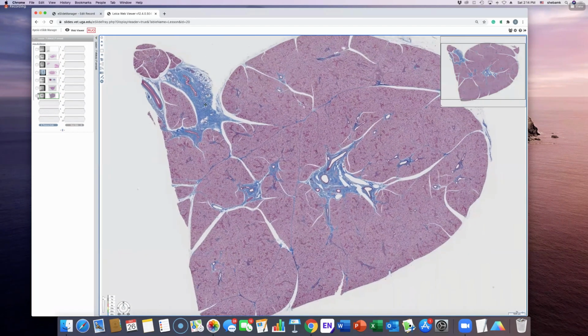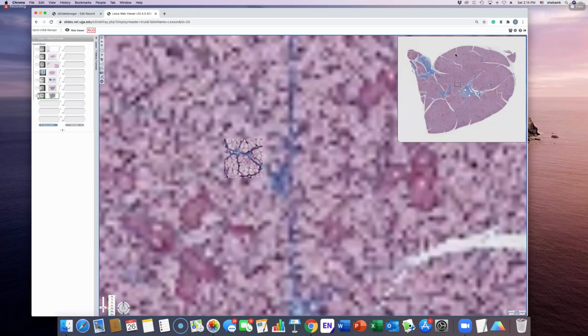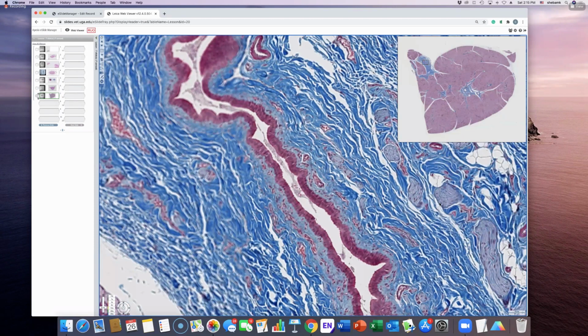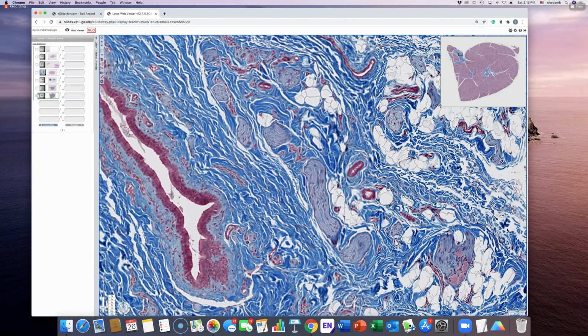at some neuronal structures right there. Maybe, oh, there they are. Okay, who are these guys? That one there, that one there, that one, that one. Fascicles? They are fascicles of myelinated or unmyelinated nerves. Unmyelinated? Unmyelinated because you don't see the myelin.